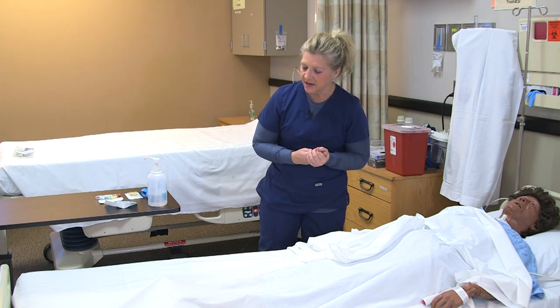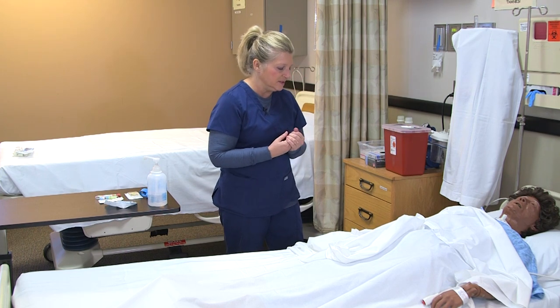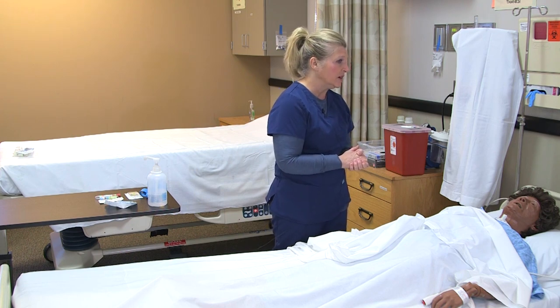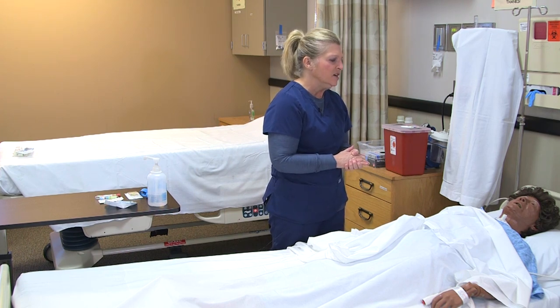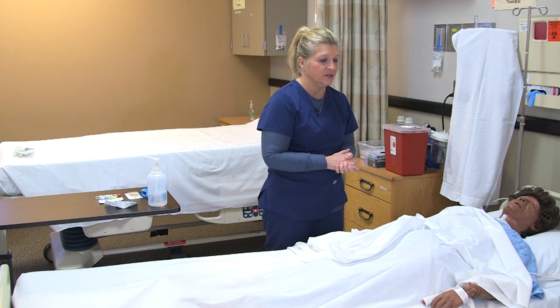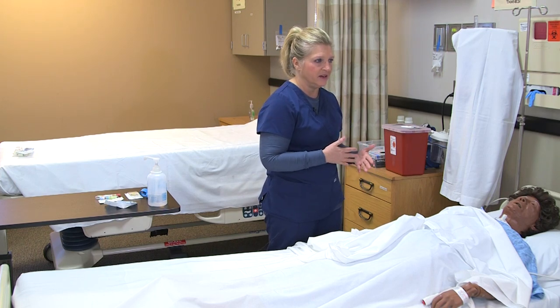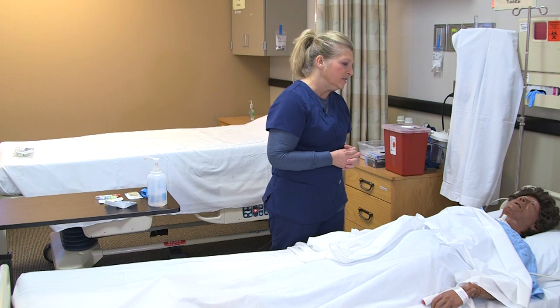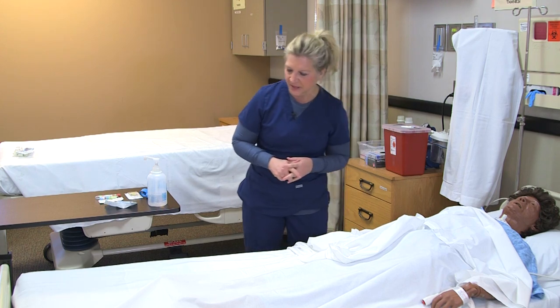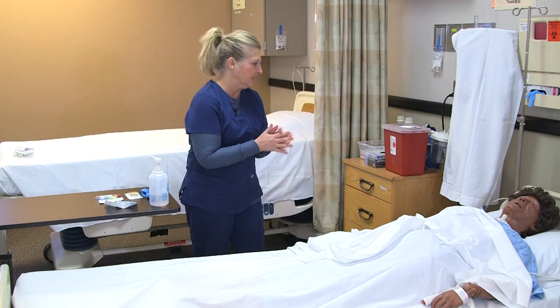I verify all of that and the patient's medical history. I ask the patient if they've had any trouble with prior blood draws, such as fainting, nausea, or feeling lightheaded. If so, make sure the patient is positioned comfortably — either sitting or lying down. Once that's confirmed, I explain the procedure, wash my hands again, and apply gloves.